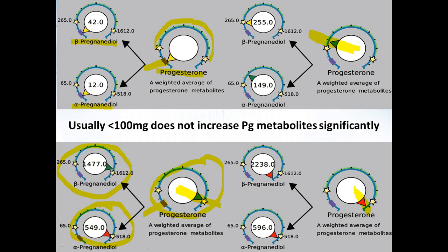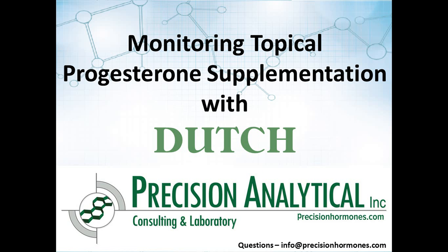So you can still examine the endogenous progesterone production while they're on low-dose progesterone therapy transdermally, but we need to put that into proper context when we're trying to make sense of topical progesterone when we're looking at the dried urine test for comprehensive hormones. And again, if this is a new concept to you, I would encourage you to watch the larger video on topical hormones that'll walk through the data and explain what to expect to see with saliva testing, with blood testing, and with urine testing with topical progesterone and other hormones, which is a fairly complex scenario.